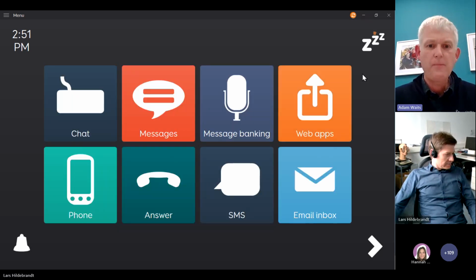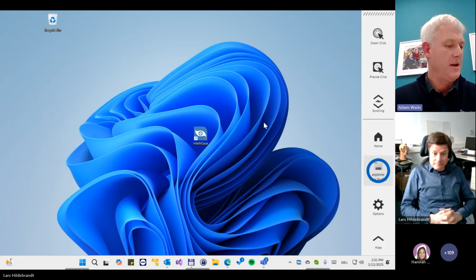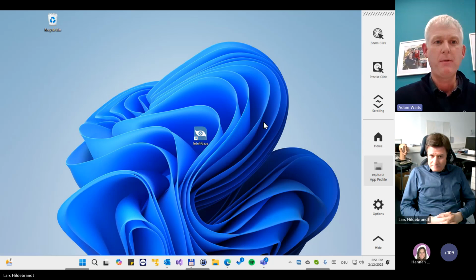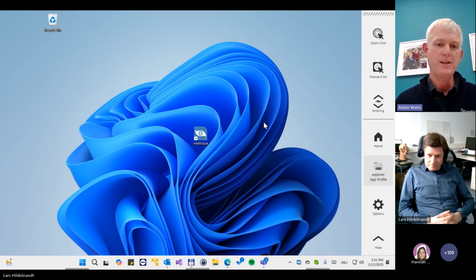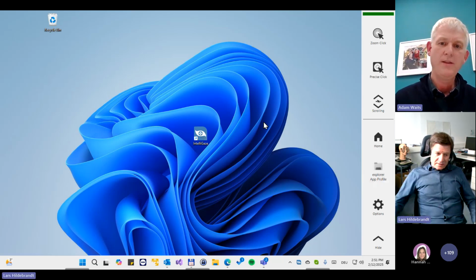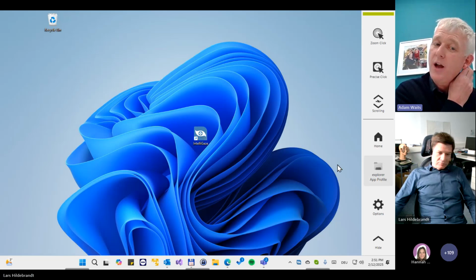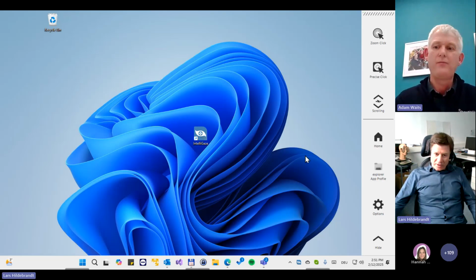Okay. Another one that came up, Lars, was what's the best way to reset a calibration? Imagine you're switching from one patient or user to another. It might be a piece of kit that's in an assessment service, for example, and you're starting with someone afresh. What's the best way to start again with a fresh calibration? Would you hit the 0-point calibration and then go again, or just calibrate the user, put it in front of the device and calibrate?